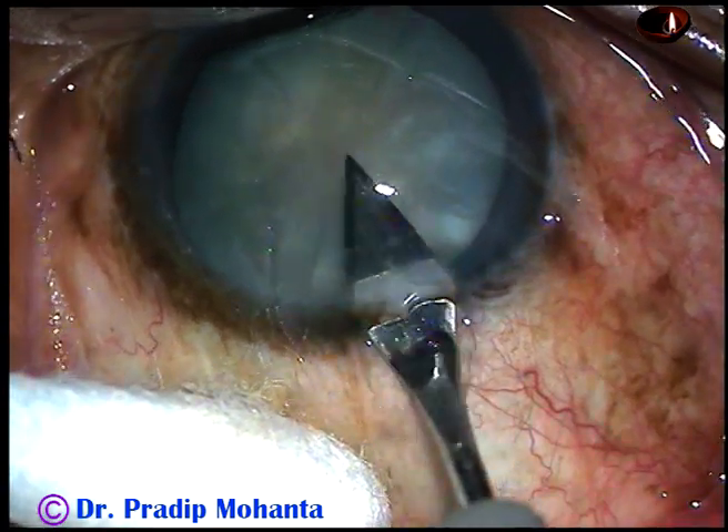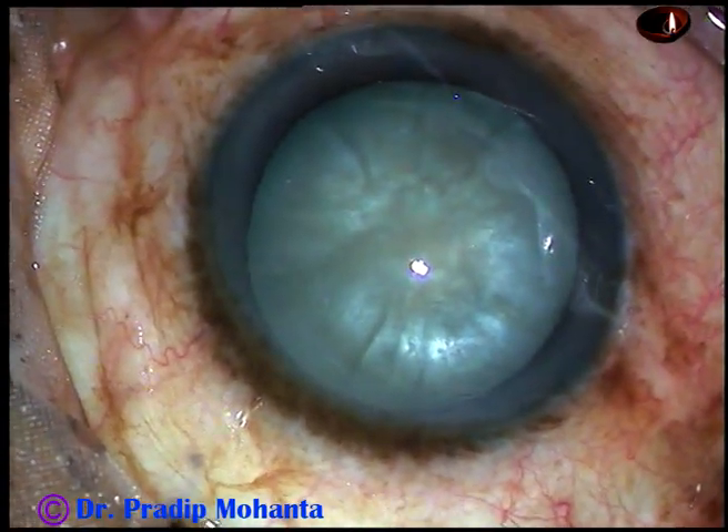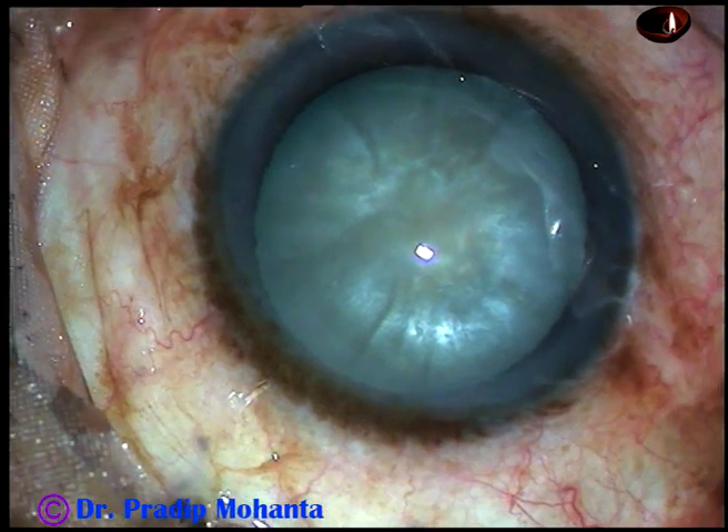This is an intumescent cataract. Let us observe the surgical steps. The main incision has been made.